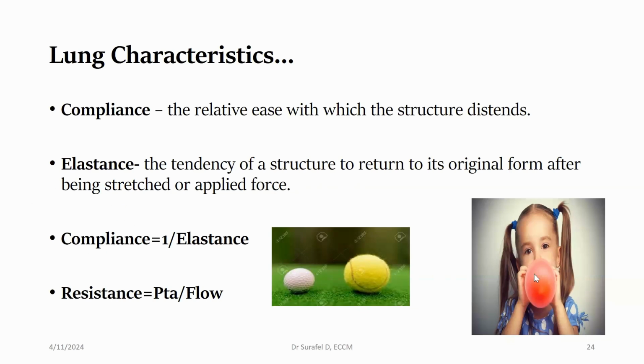As you can see, this lady doesn't look like she has difficulty ventilating. She's actually enjoying it, but what I'm trying to demonstrate here is that you will have significant difficulty while inflating the balloon at an early stage. Once the balloon starts to inflate, that means once the alveoli are starting to open up, it will be easier and easier to inflate.